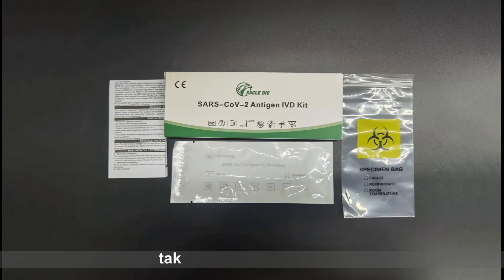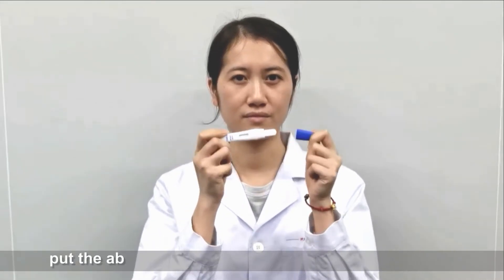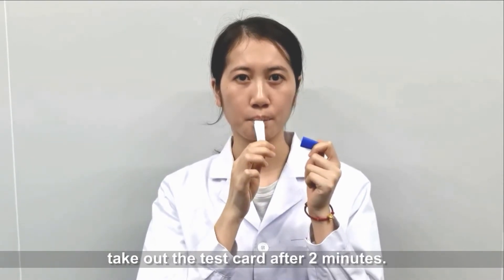After the test card returns to room temperature, take out the test card. Remove the blue cover of the test card. Put the absorbent tip of the test card into the mouth and take out the test card after 2 minutes.